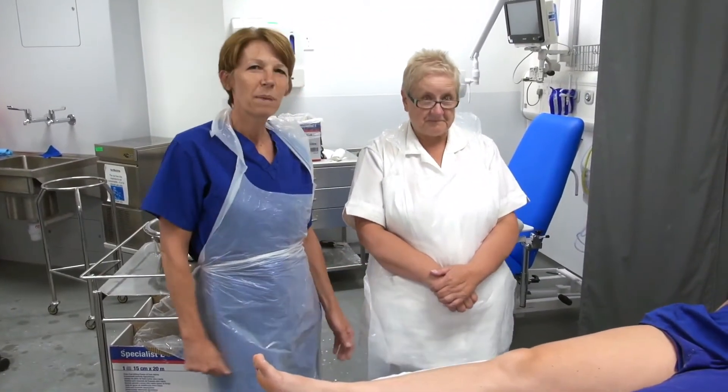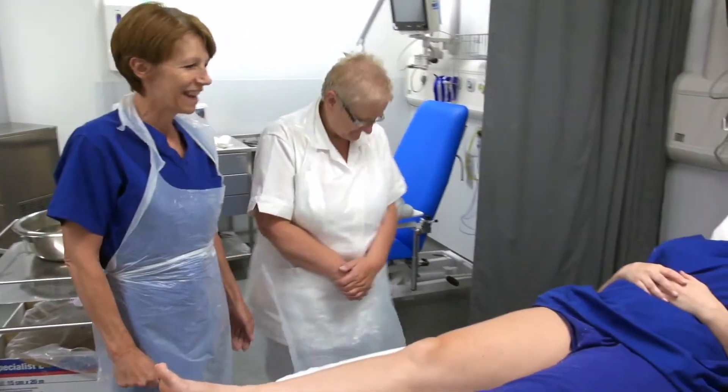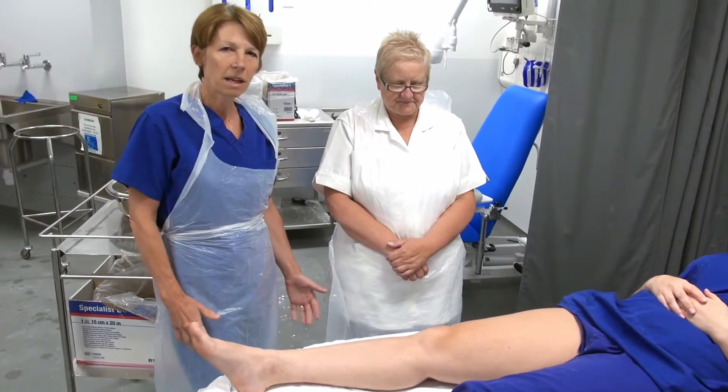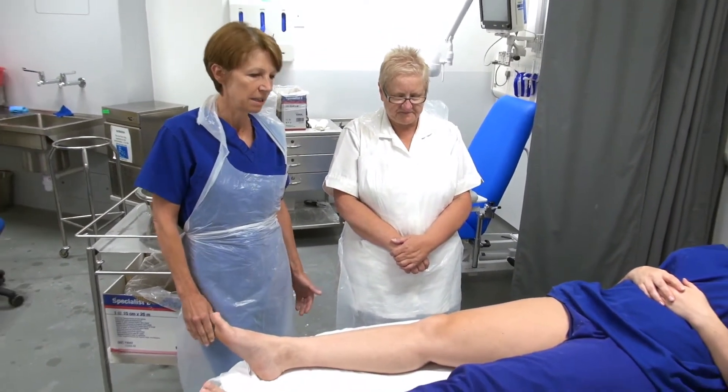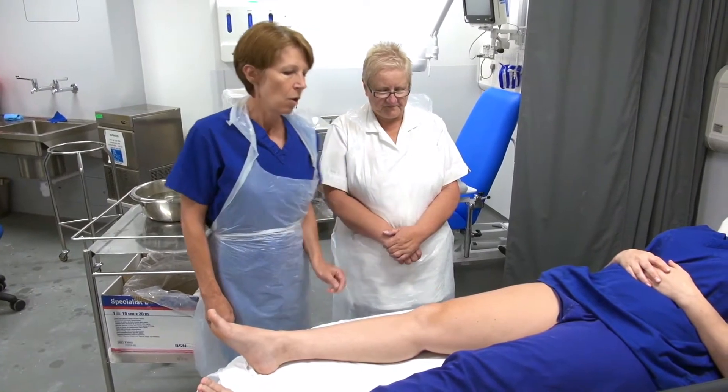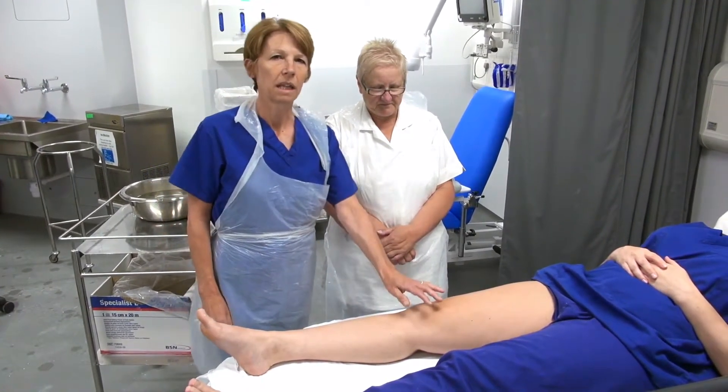Hello, I'm Sue and this is Pam, our plaster technician, and we've got our lovely model Anne. This time we're going to demonstrate how to put on a back slab, and this is going to be a cylinder back slab. This would be used for a dislocated patella or a fracture to the patella.